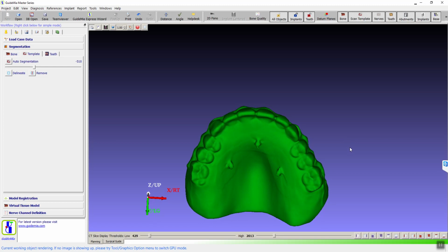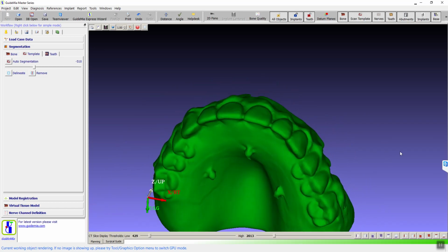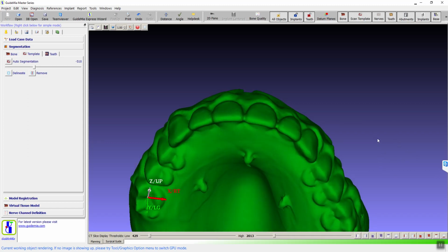Well, I actually didn't realize this for the SureMarkers, because they are spherical in shape, right? They have a single point. Theoretically, they have a single touching point with the guide itself, so that might cause the problem. Very likely, I would say.